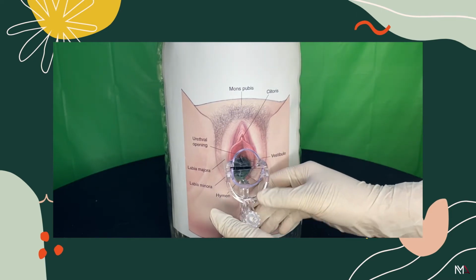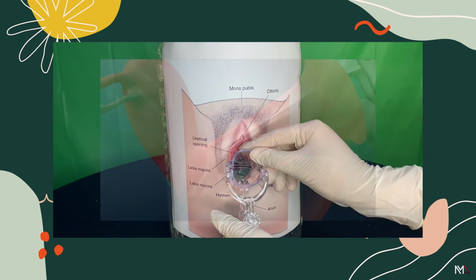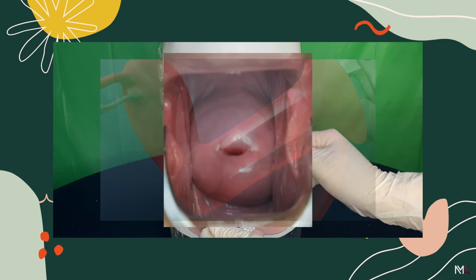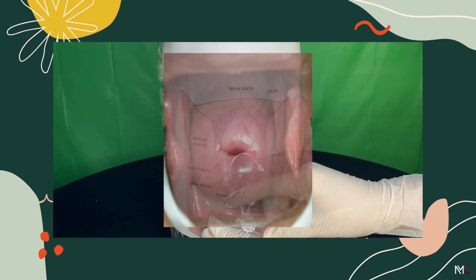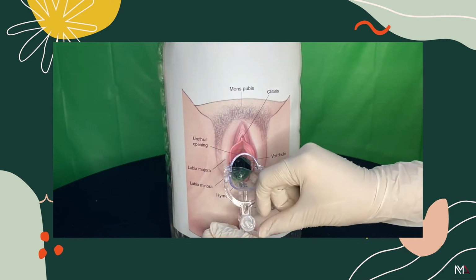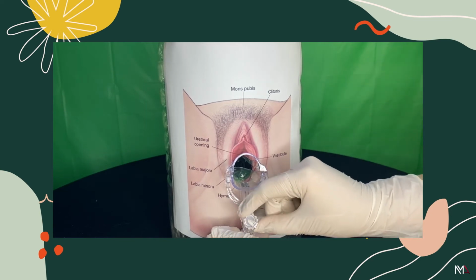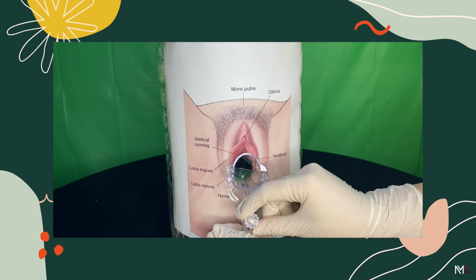The blades should be inserted to their full length and then opened so the position of the cervix may be inspected. Once the cervix is visualized, the speculum is opened and the introitus is widened. This can be done by using the screw adjustment on the base of the speculum.